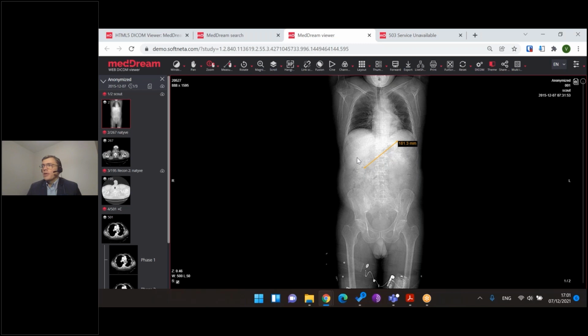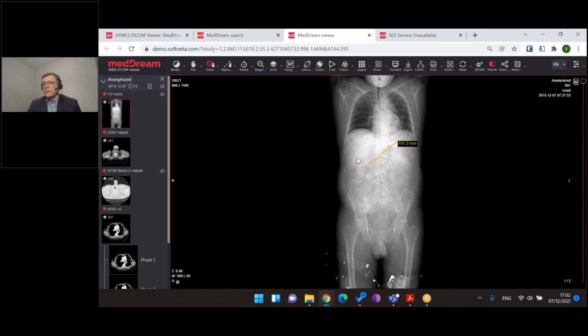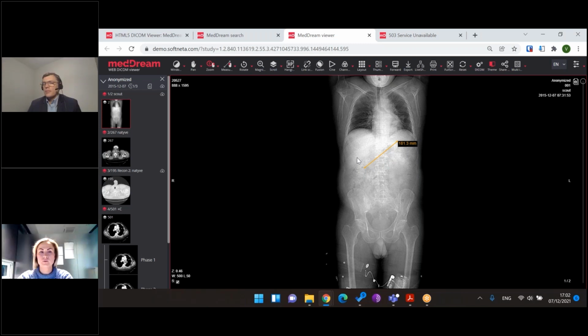I believe if we speak about the visual features, for today, it's everything which I wanted to present. And now, Renata, maybe we can switch to the questions and also to your announcement. Yes, of course, Vytautas. Okay, we got some questions during the webinar. First, I'm going to read the questions we got before the webinar.